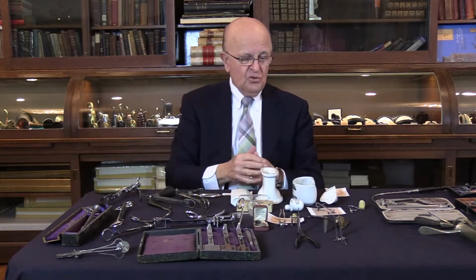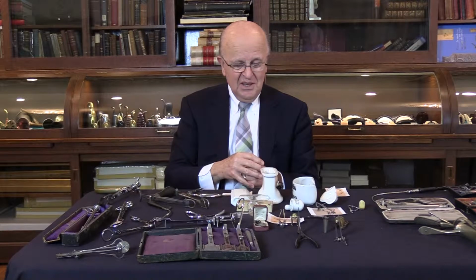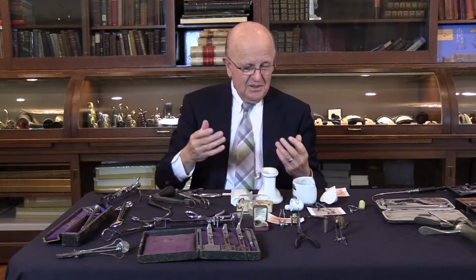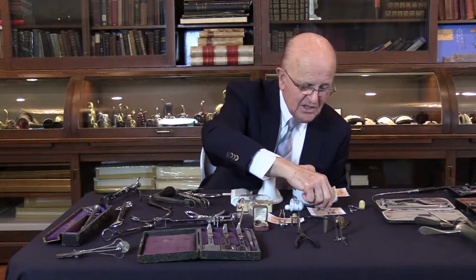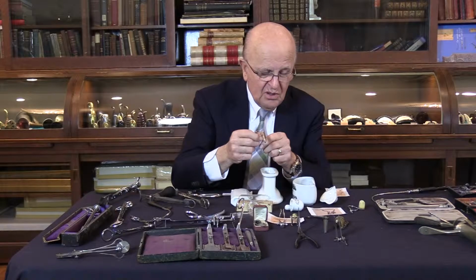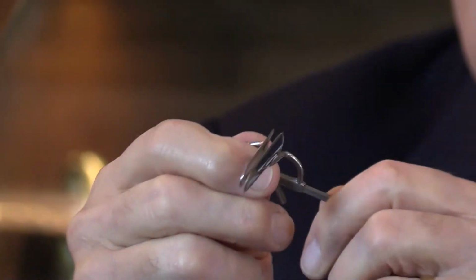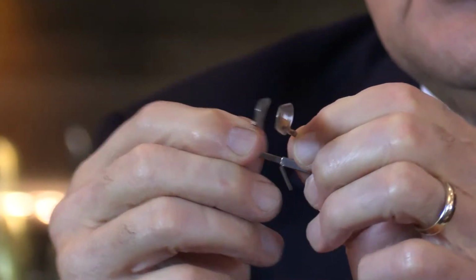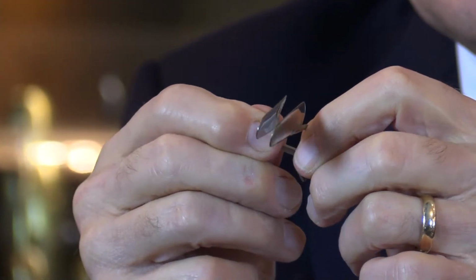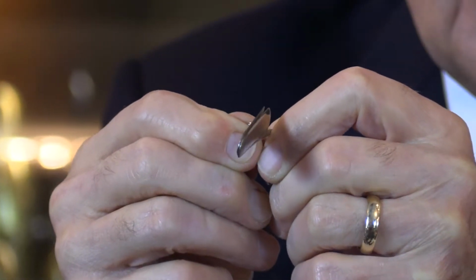The next area I want to share with you is the nasal field. There is the early nasal speculum, which is this kind, and it's called the Myle's, M-Y-L-E apostrophe S, the Myle's, and that will open and close. As you can see, it's a little bit difficult and time-consuming to adjust it.